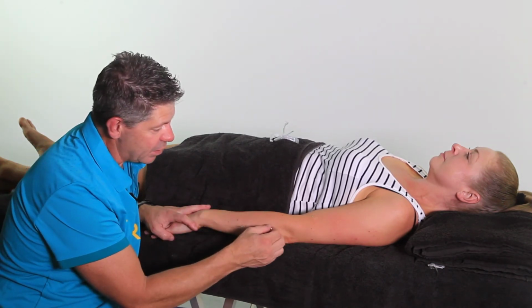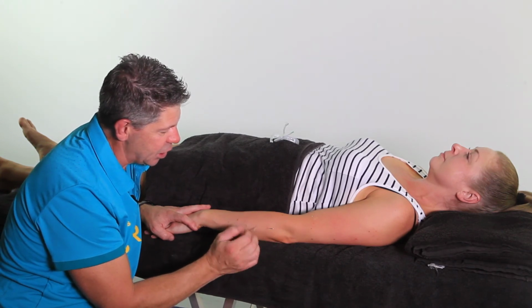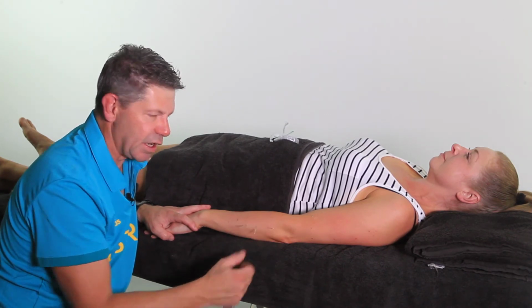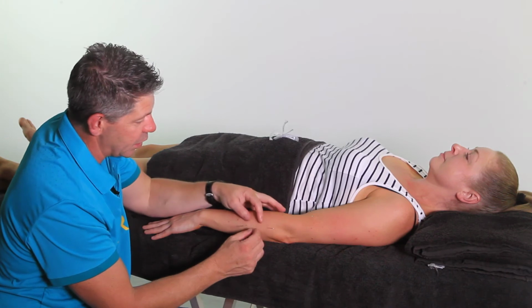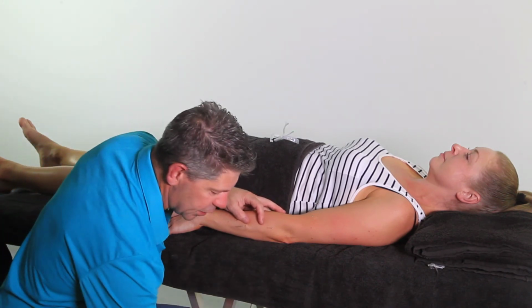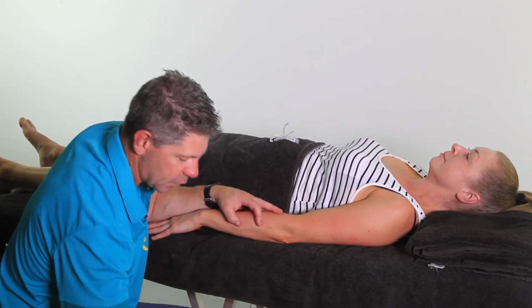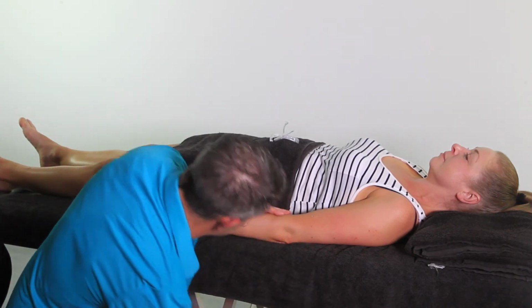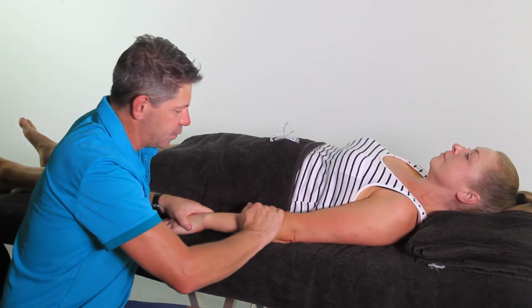Once the needles, we've just jiggled them about and they're not feeling any more sensitivity, that will lead us to think, well, okay, the needles have been in long enough. So simply put, all we need to do, take them out straight into the sharps container, like so, and then always follow up with some soft tissue work as well.